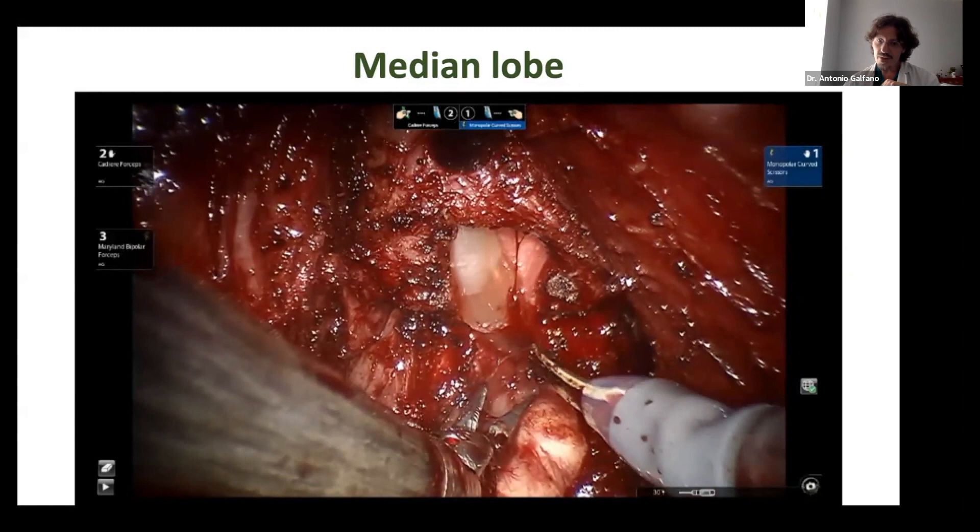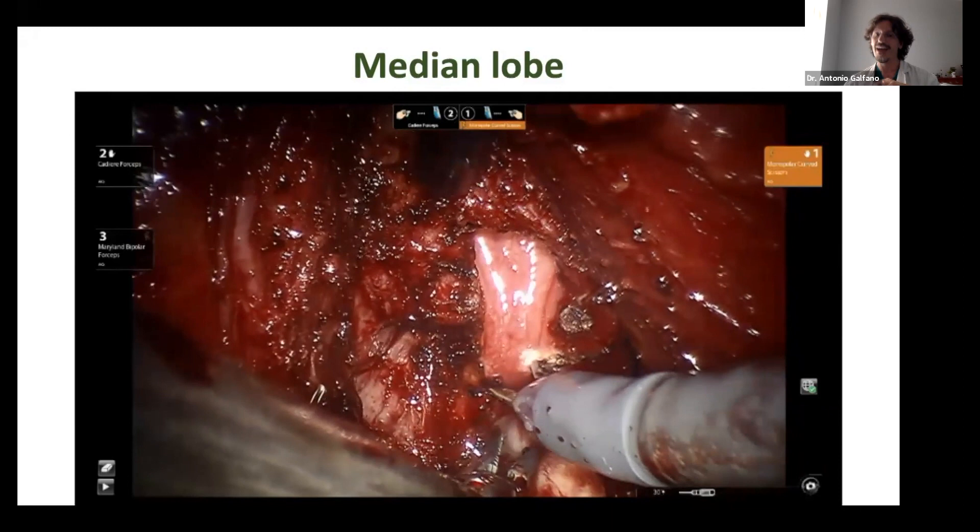The anterior part of the patient with median lobe or anterior median lobe follows the same steps.